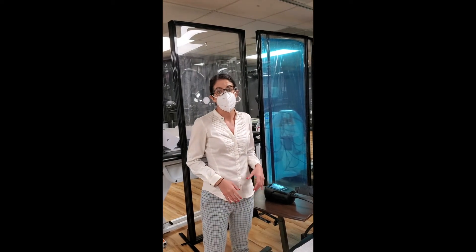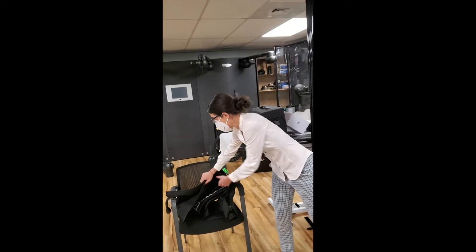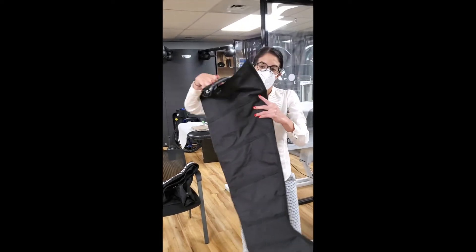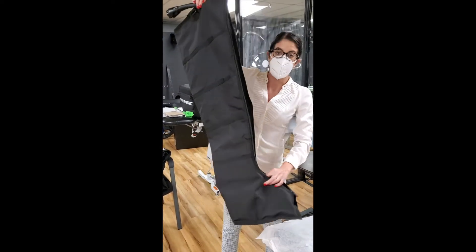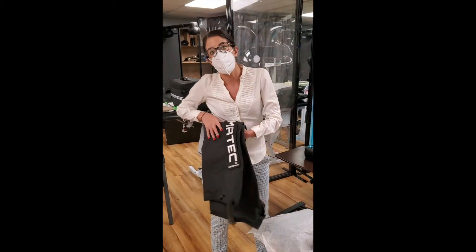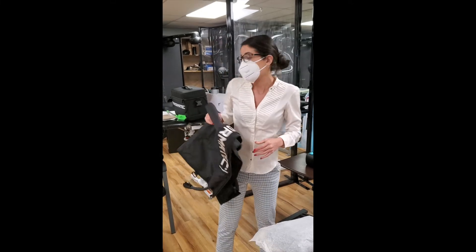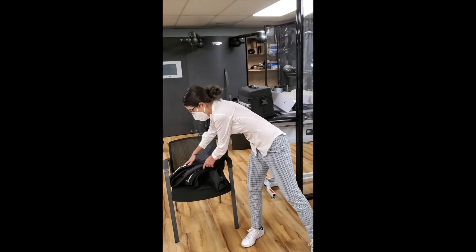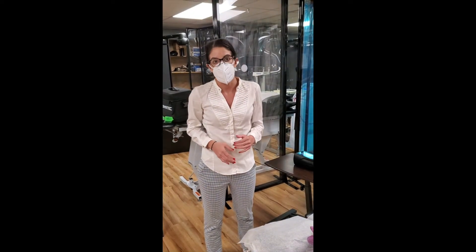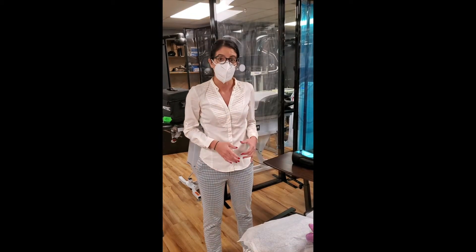We've had the NormaTec for the lower extremity for quite some time now. This is one of the lower extremity units. We have this for both legs and we've been using it for a long time — not only with our lymphatic patients, but also with our athletes who have difficulty recovering from workouts, or our patients who are post-op knee replacement or hip replacement with a lot of inflammation.